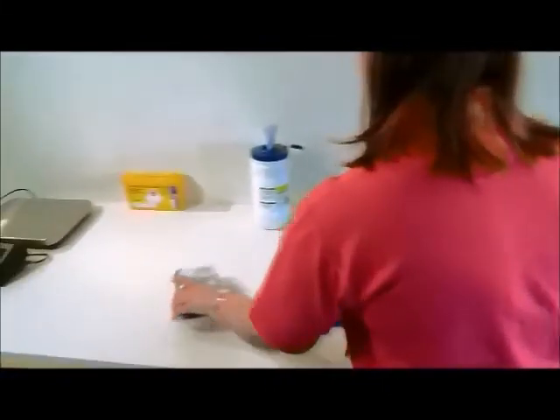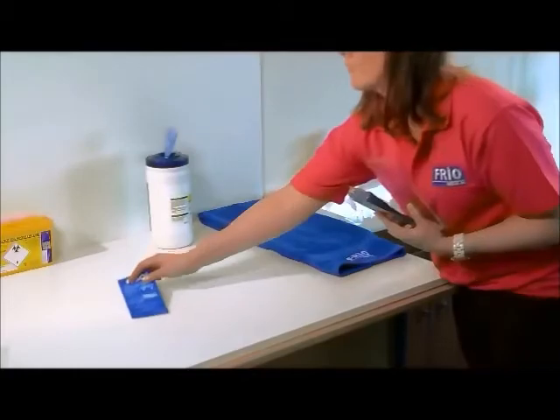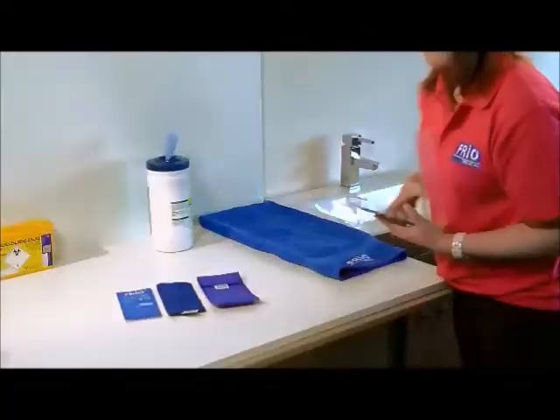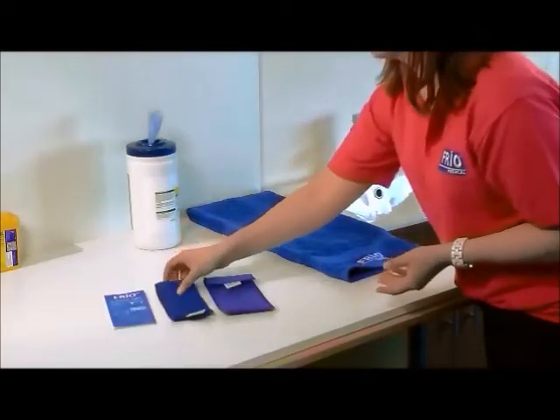To activate the Frio Wallet, you'll need access to water. First, remove the wallet from its packaging. The Frio comes with an inner wallet and an outer cover. The inner wallet contains crystals which activate when soaked. The outer cover allows the wallet to breathe.